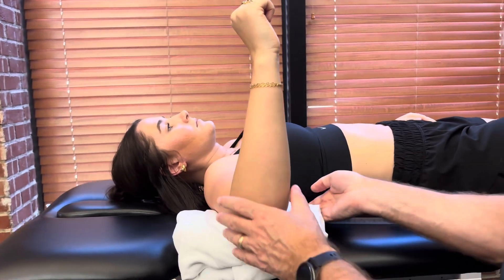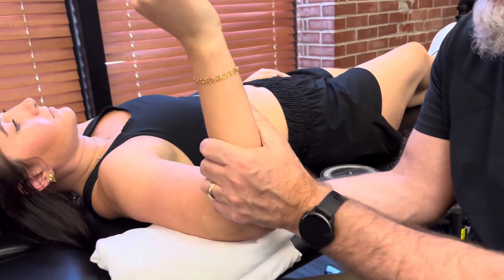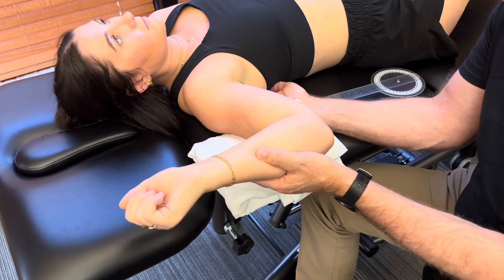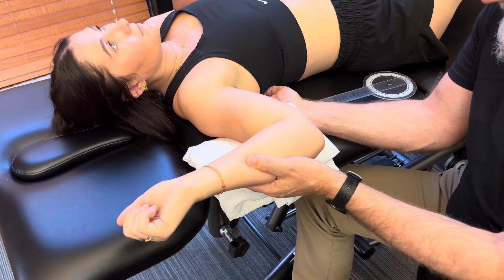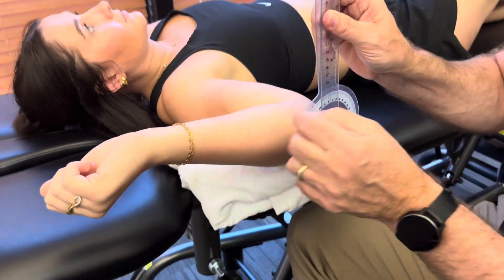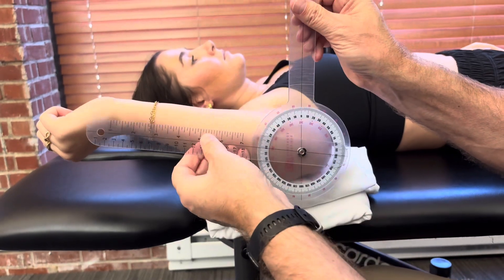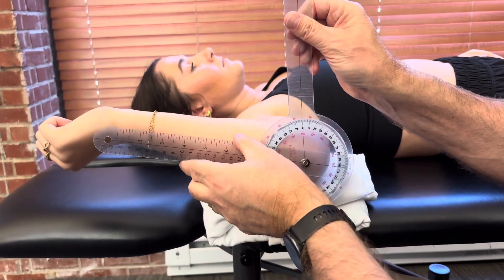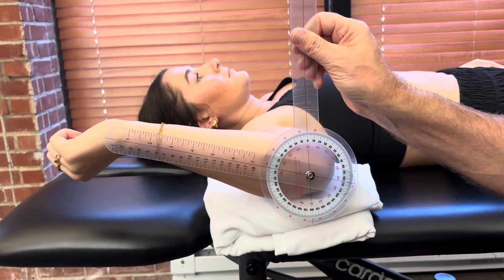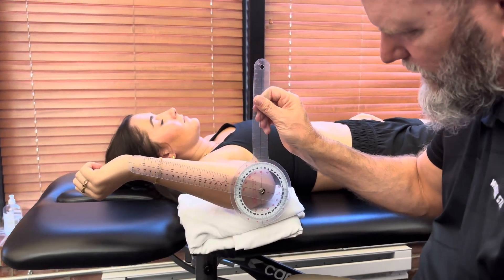With this measurement I'm going to reach under her scapula and I want to palpate as she externally rotates until I feel her scapula posteriorly rotating — that is where I feel her scapula rotating against my fingers. So I line up my goniometer again: axis on the olecranon, the proximal arm vertical, and the distal movable arm against the midline of her ulna. She has isolated glenohumeral external rotation of 75 degrees.